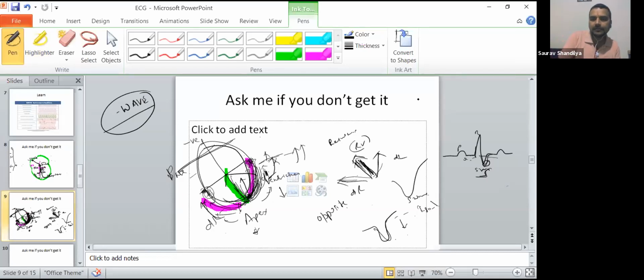Is there any kind of clarification still you want? Reverse direction? Yes, it is a reverse direction, but it is a resultant current. It's the imaginary thing I have taken. In fact, it is a recording part of that I have taken, that when you have a recording terminal, which is from the negative to positive, of course, the current is going up.